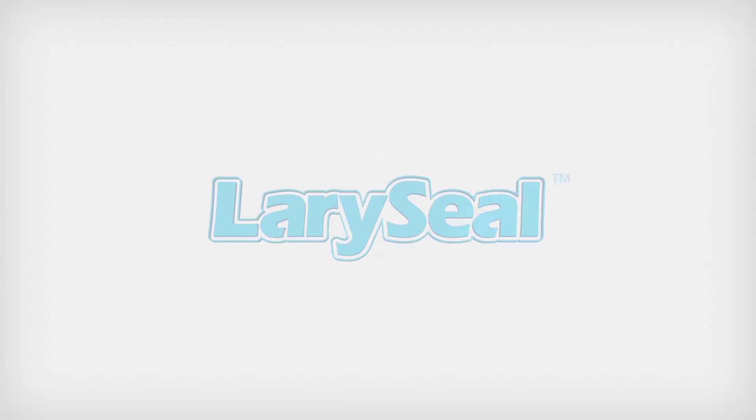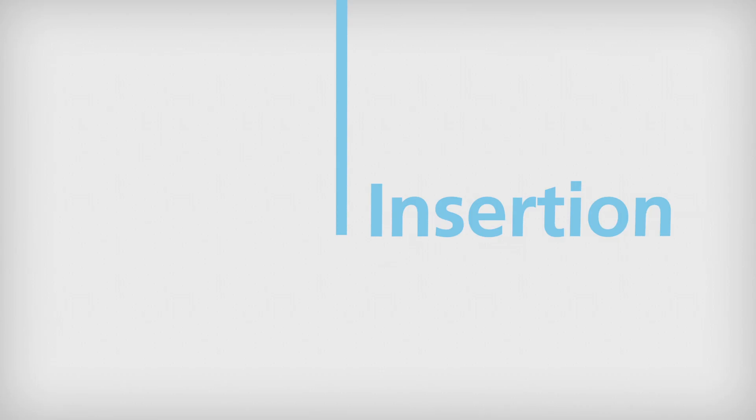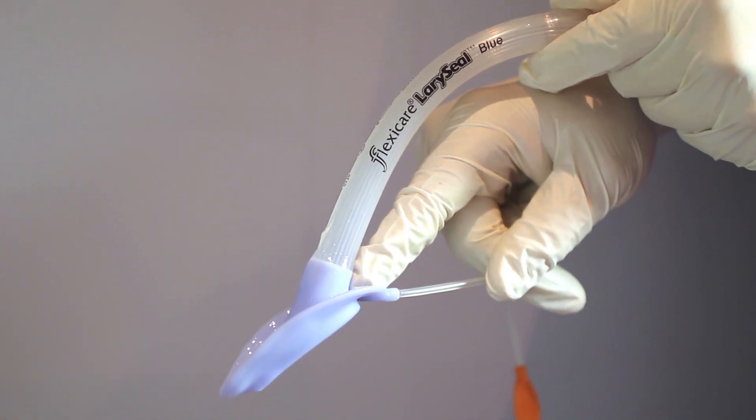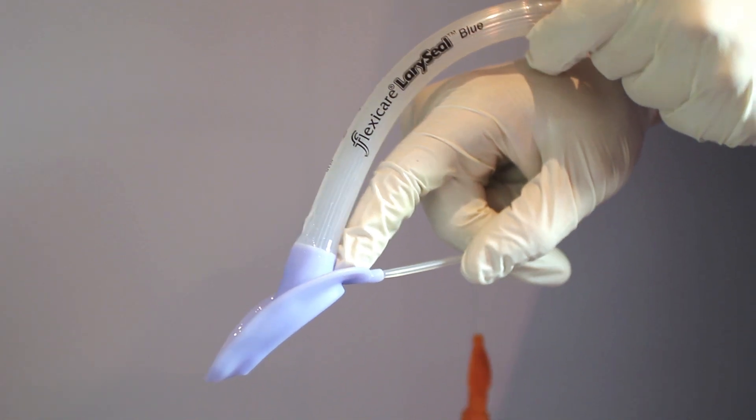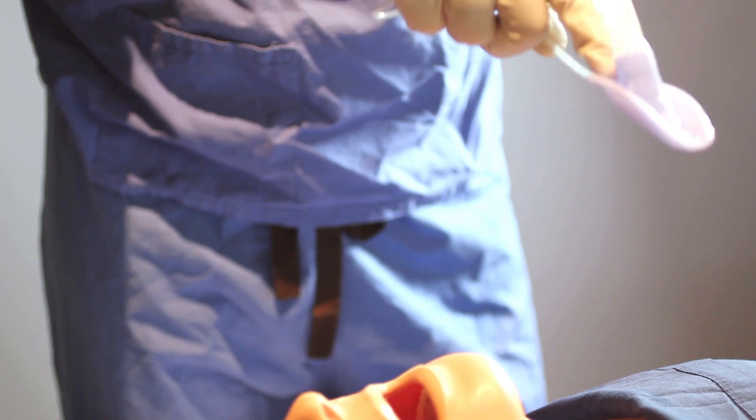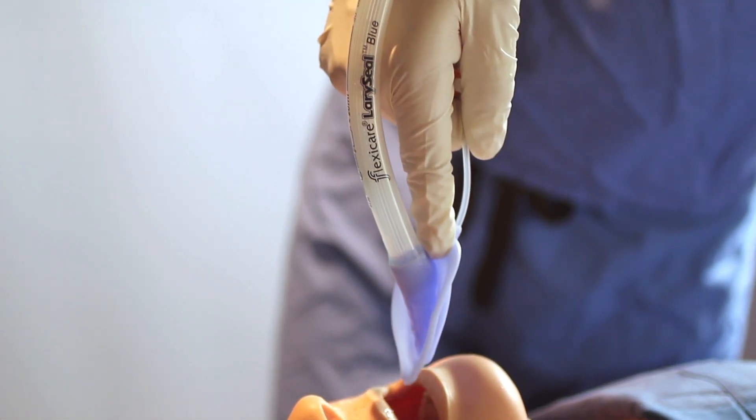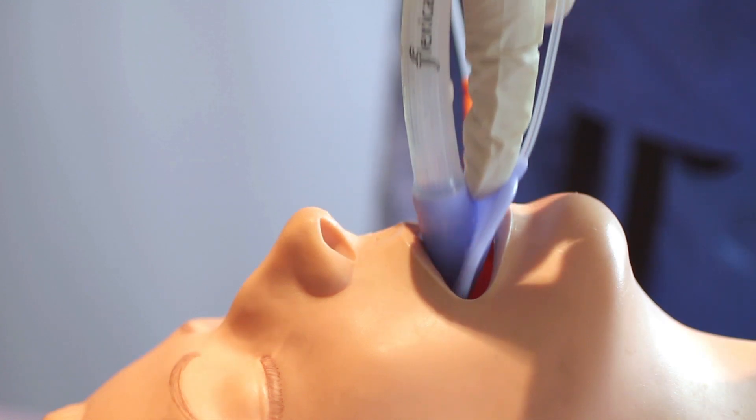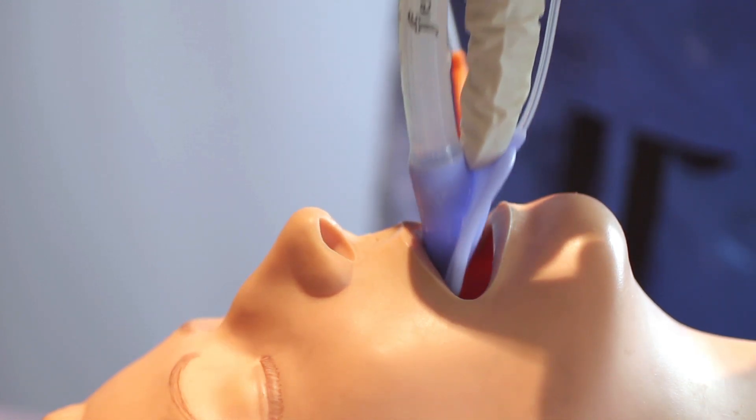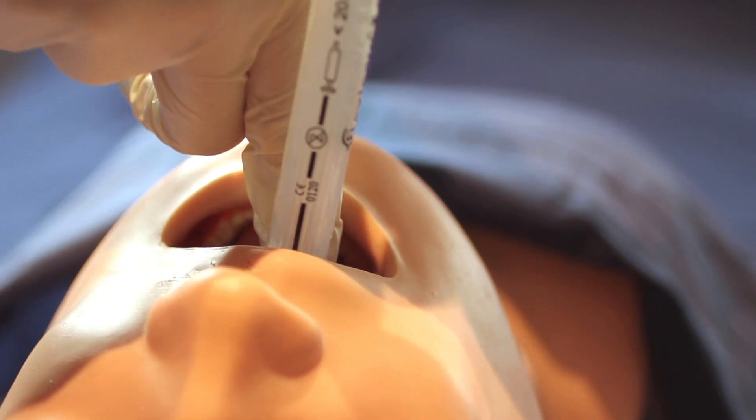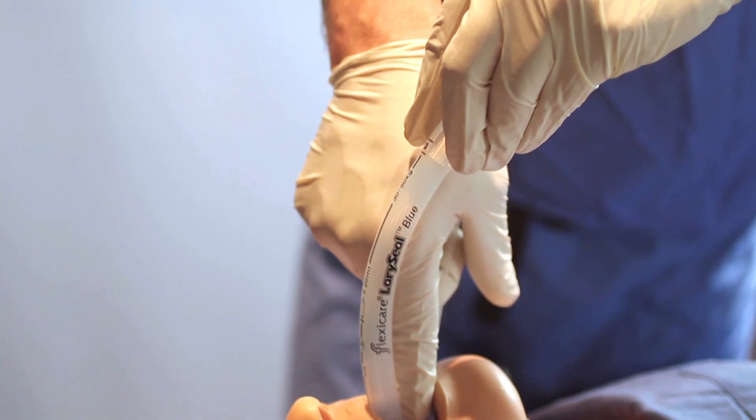Place your index finger behind the patient cuff between the juncture of the inflation line and the main tube and grasp the Laracel Blue securely. Place the tip of the Laracel Blue patient cuff just behind the patient's upper teeth against the hard palate. Massage some of the lubricating gel contained on the back of the patient cuff against the hard palate before advancing the Laracel Blue with a definitive force into the patient's airway.